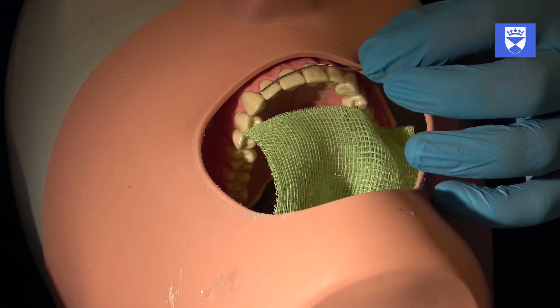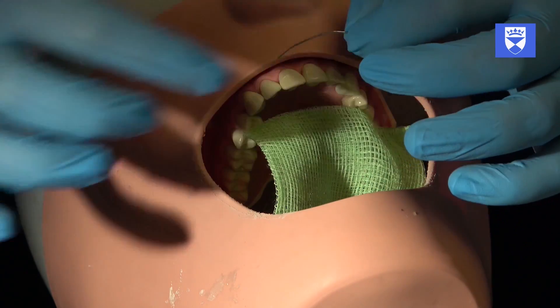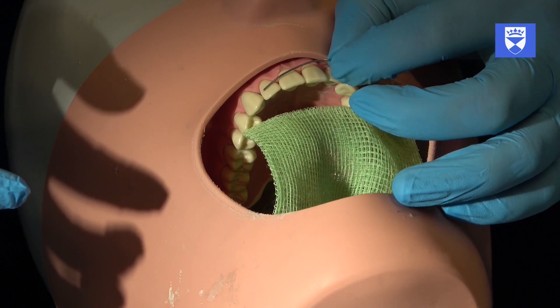We now safely cut the wire at the junction between the safety handle and the splint points, holding both parts at the cut.